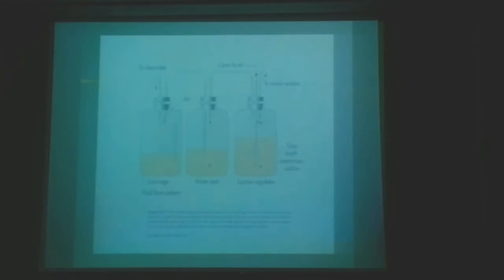Okay. So, if the patient inspires again, he will create more negative pressure, right? The air will try to come in from where? From here. This one is open to the air, right? Suppose the air comes from here, it will try to go inside the patient to the chest tube. What is on its way? Water. It cannot come.